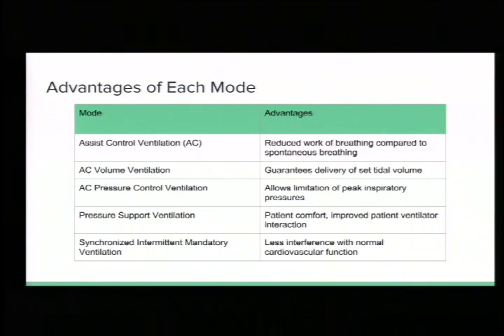Not what you put them on initially when they're paralyzed and sedated, but moving towards. Or SIMV, might see this on a post-CABG patient who's waking up and doesn't stress the cardiac function as much, allows them to do some of their own breathing, but they may need the vent a day longer than they should have just in the OR. So those are the kind of patients you'll see on SIMV.